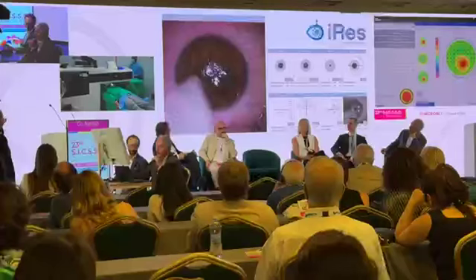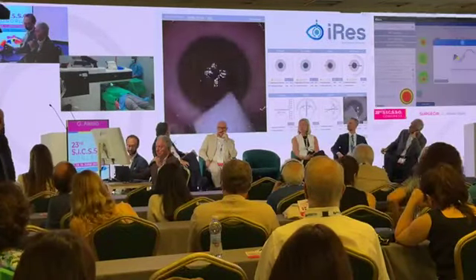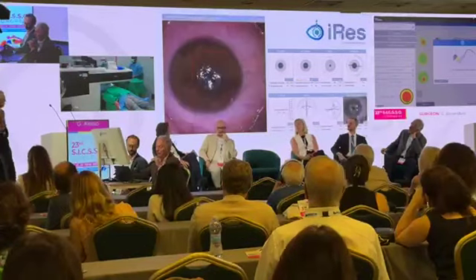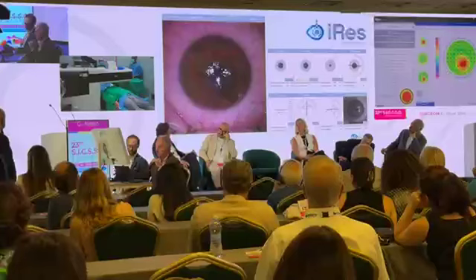Okay, dry the cornea, please. Okay. I'm starting.